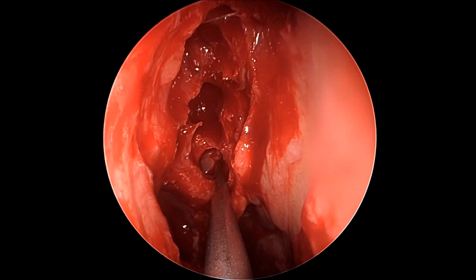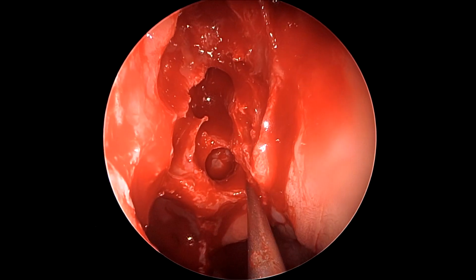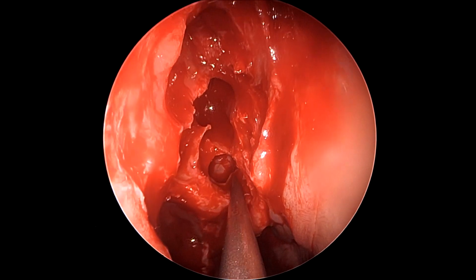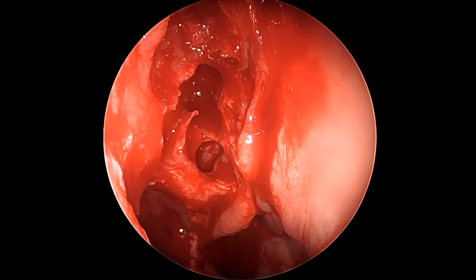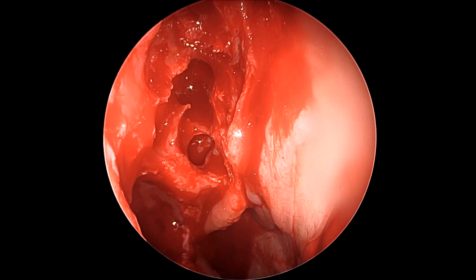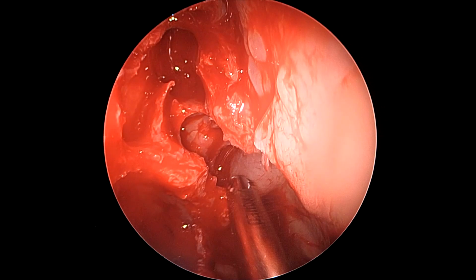All these partitions in the party walls will need to be removed because that is very fundamental to any sinus surgery. Not removing the entire ethmoidal septations, leaving behind septations in the anterior and posterior ethmoids, is often a cause for surgical failure or disease recurrence. This is often an understated cause of failure.